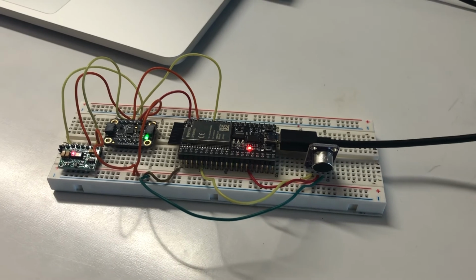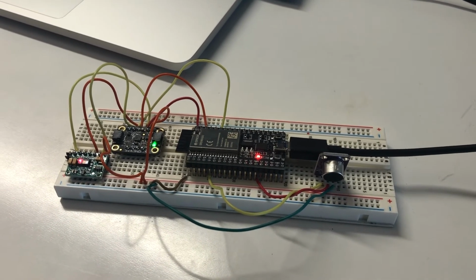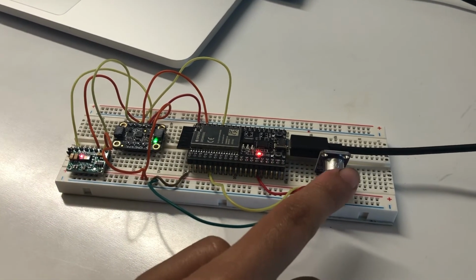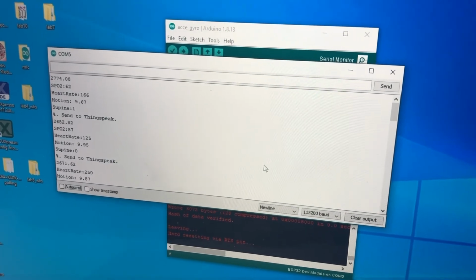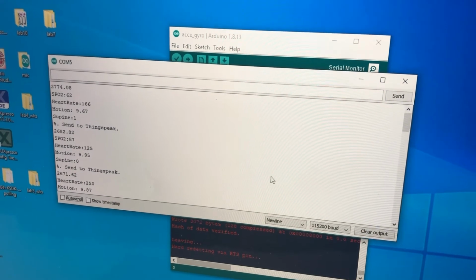Okay, so putting all the components together for our final system, we have code for our accelerometer gyroscope, the pulse ox and heart rate monitor, and the microphone, which I've already loaded onto the board. And so basically each value is read, which I already tested. So you can see the oxygen saturation, heart rate, motion, and whether or not it is supine.